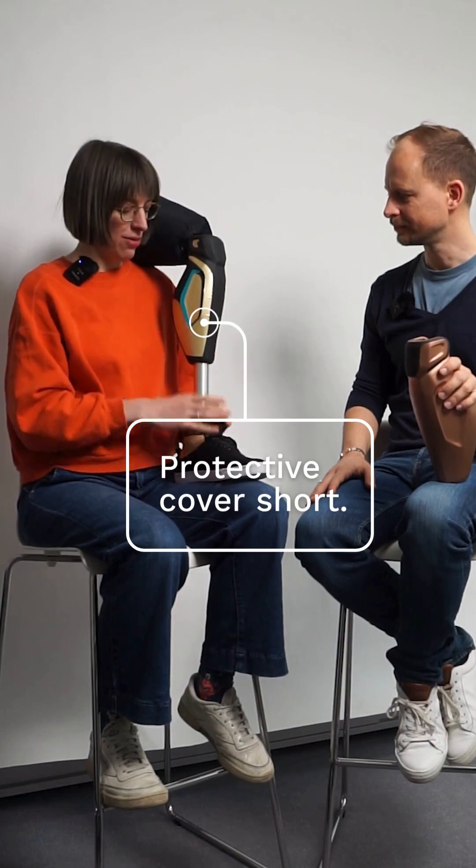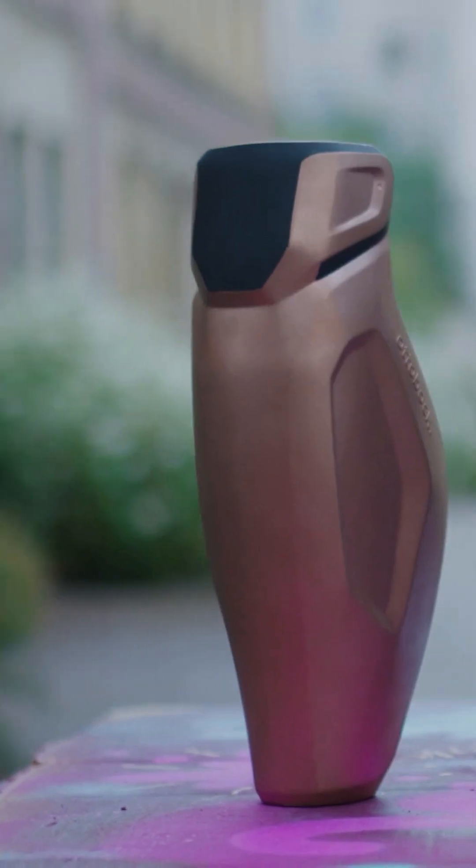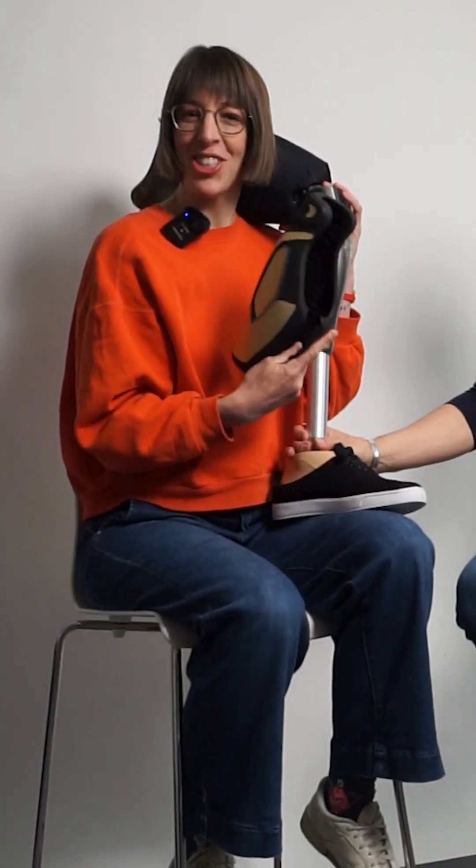This is the protective cover short. As you can see, it is not only black because you can individualize it yourself — you can either spray paint on it or put stickers on it. And you can put it in a dishwasher to wash it.